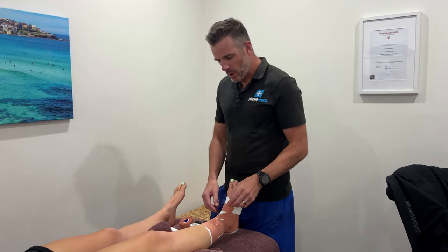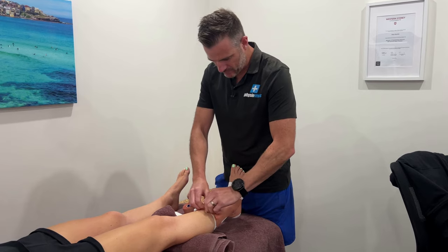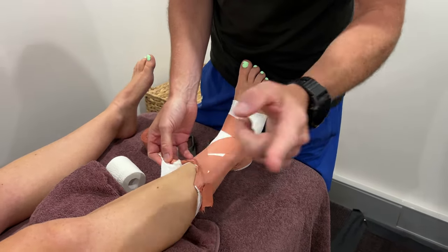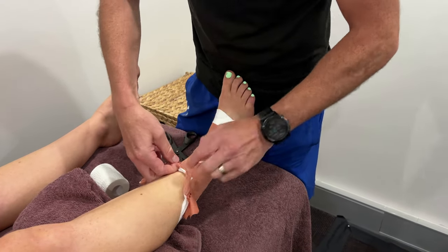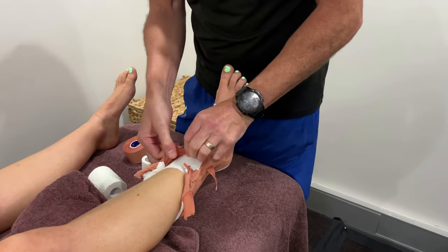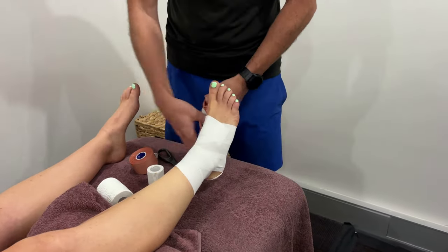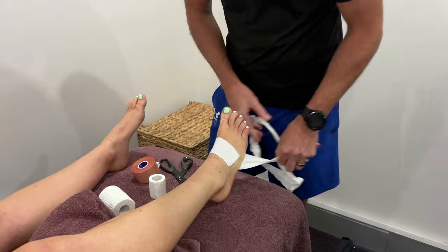To take it off, undo or cut a little channel at the top, then use scissors to come underneath and cut the rigid tape carefully, watching the skin. Rip that off — the rigid tape rips well sideways. Then peel the tape away and unwind the crepe underwrap. You'll find it comes off really nice and easy and doesn't hurt the skin or pull anything off. And that is how you take it off.